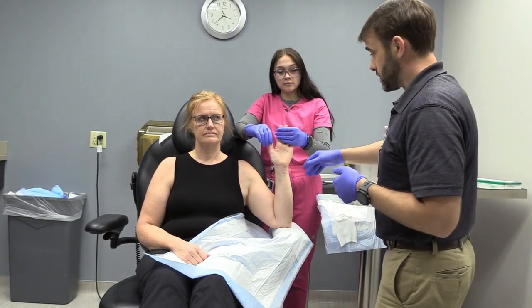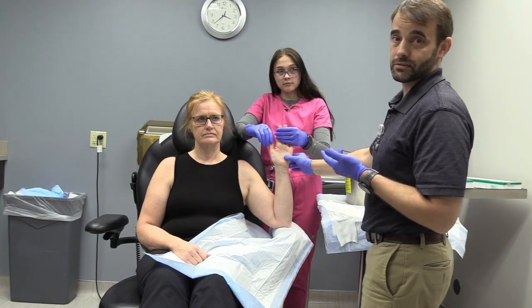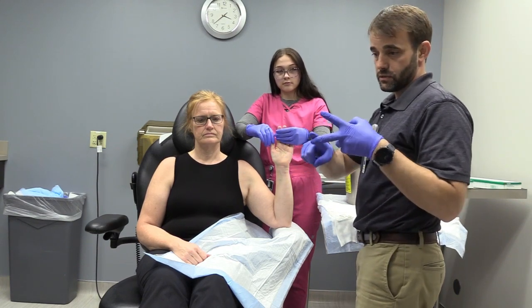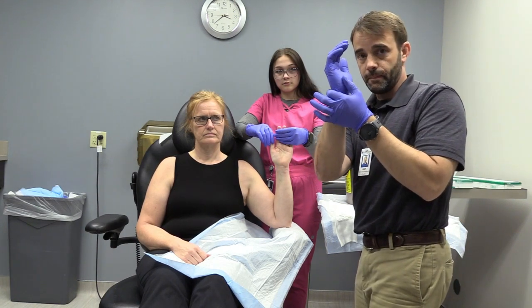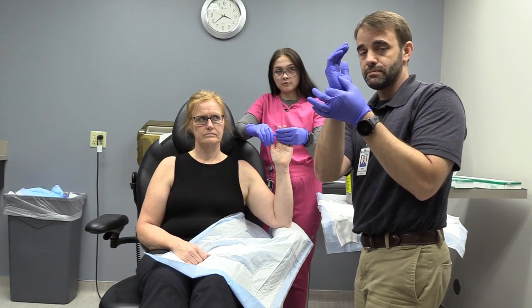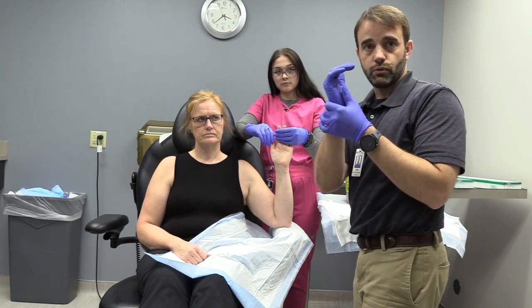So starting with the ulnar gutter, it's usually done for fractures of the metacarpals, usually the boxer's fracture, but also the metacarpal base fracture. There's two things you should know about boxer's fracture versus metacarpal base fracture. With the boxer's fracture, you'll often be more comfortable with the hand kicked back just a little bit. With the metacarpal base fracture, that often causes some pain, so you'll want to just put the wrist in a more neutral position.